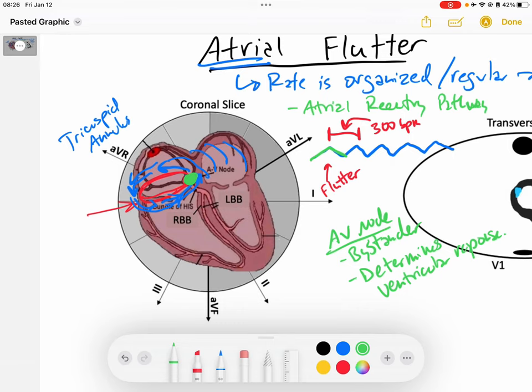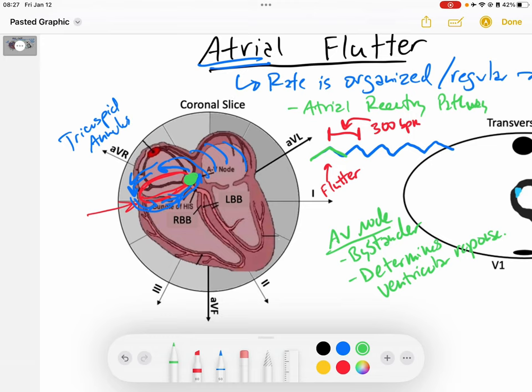The AV node determines whether it's conducting every two, three, or four flutter waves. The health of the AV node can be influenced by ischemic heart disease, sympathetic tone if you're in a fight-or-flight state, or medications that slow the AV node down, like diltiazem or metoprolol. So the AV node is going to conduct at a certain rate.